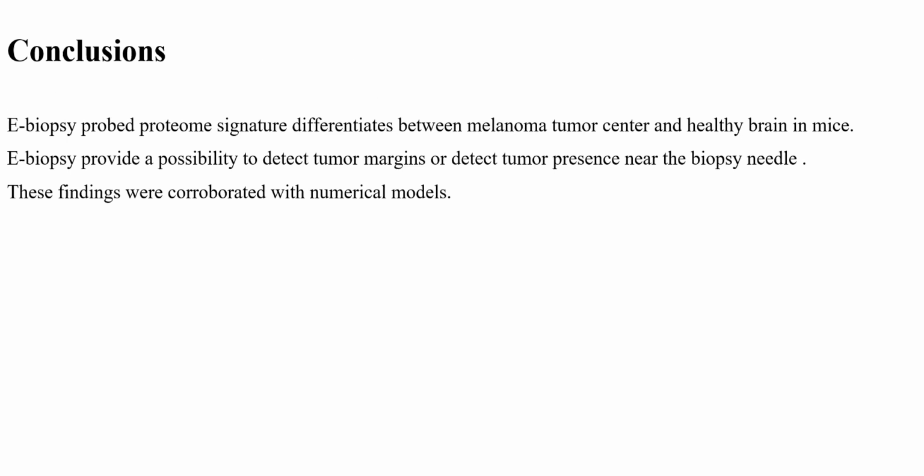We demonstrated E-biopsy could provide a possibility to detect tumor margins or detect tumor presence near the biopsy needle, with the potential to reduce false negative results of needle biopsies. These pivotal findings were corroborated with a numerical model, which serves as a first estimation of the sample tissue areas using E-biopsy.